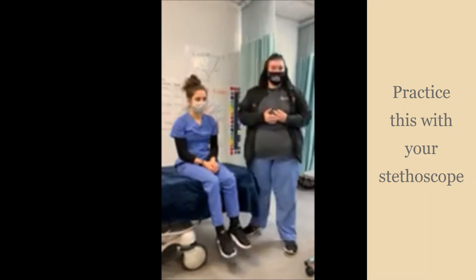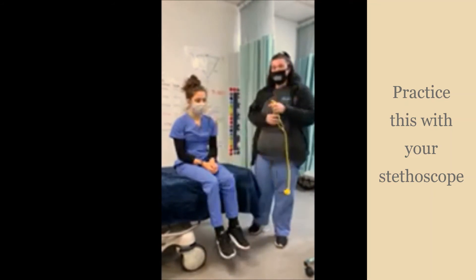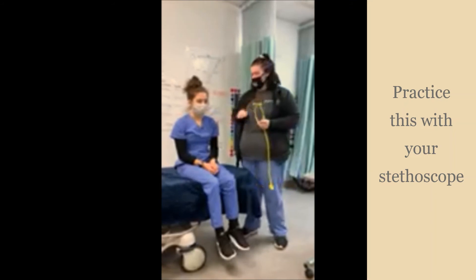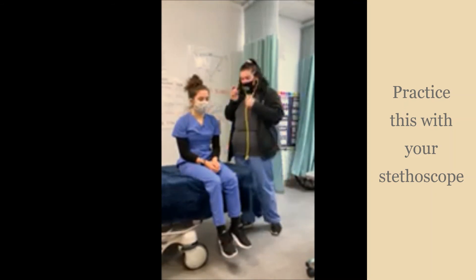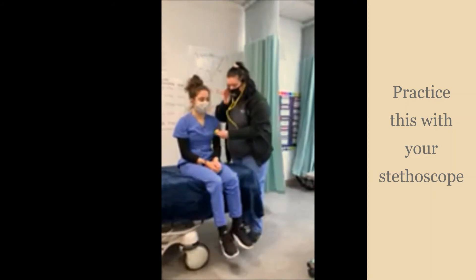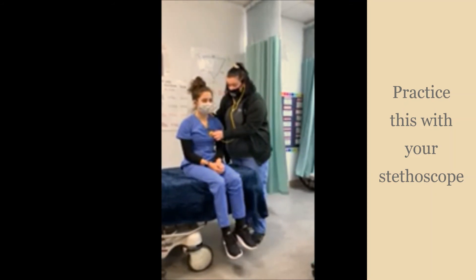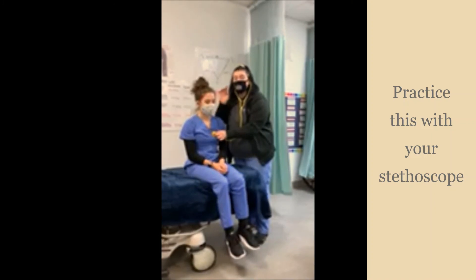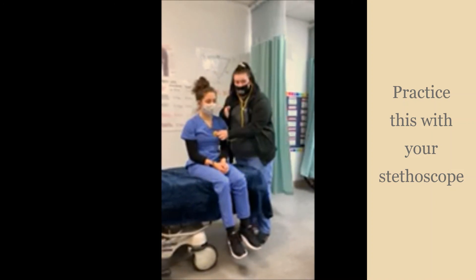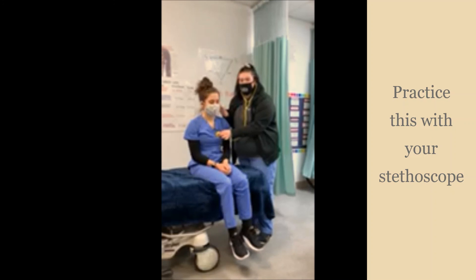Another way you can find the heart rate is with a stethoscope — you have a yellow one in your box. You'll find the apical heart rate, which is located right about here. Put your stethoscope in and place it right above the nipple line and to the left. What you're going to be listening for is a lub-dub sound that your heart makes when the valves are closing. One lub-dub is a complete cardiac cycle — that's one beat. Count that for 60 seconds and you'll get your heart rate.